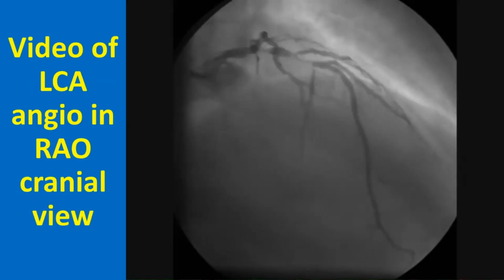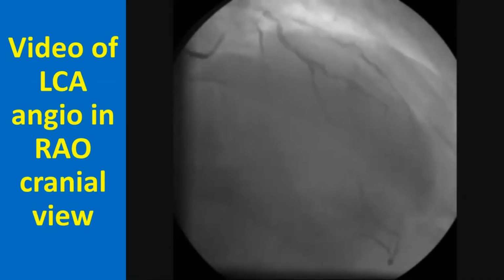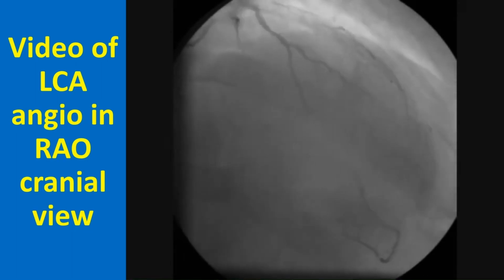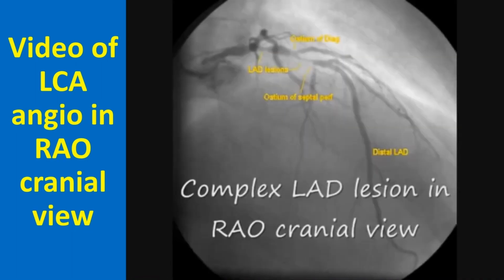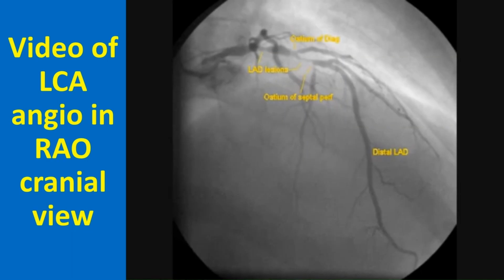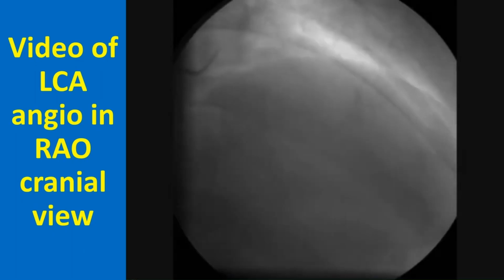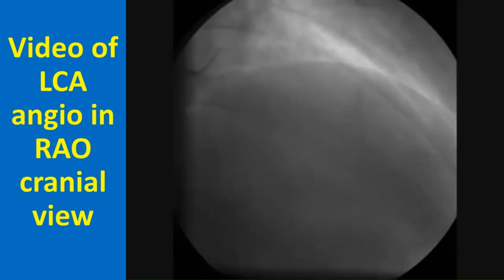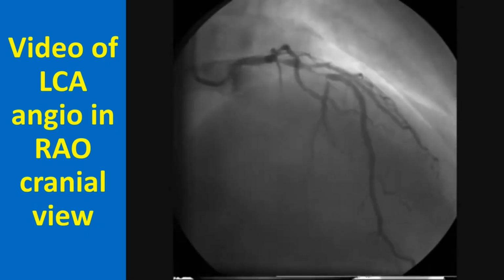Video of left coronary angiogram in RAO cranial view showing a complex lesion in the LAD. The LAD can be seen wrapping around the apex, type 3 LAD. In type 1 LAD, it will stop short of the apex, and type 2 will reach up to the apex.